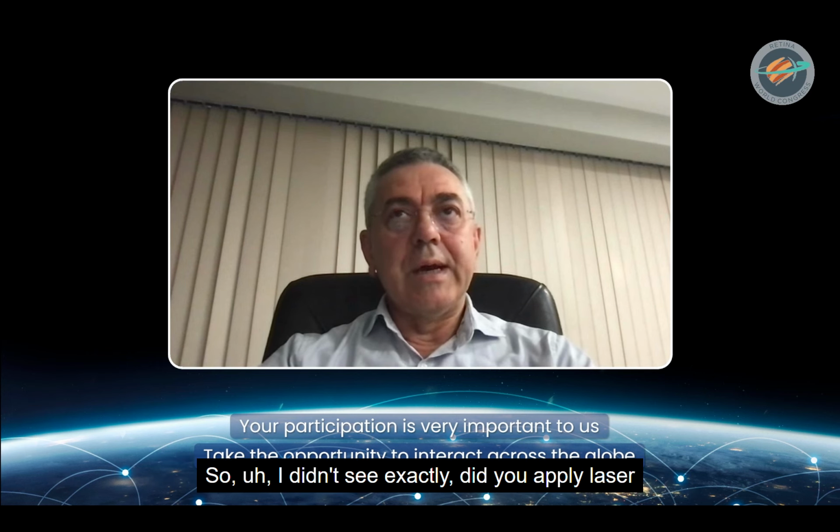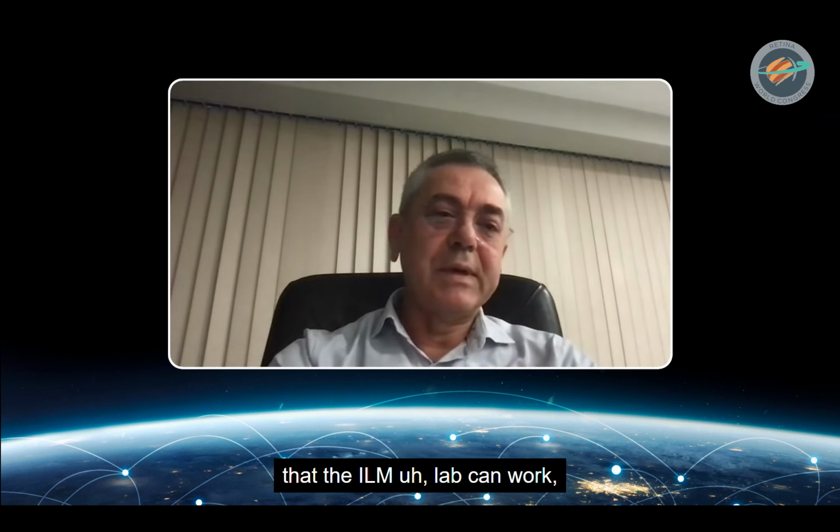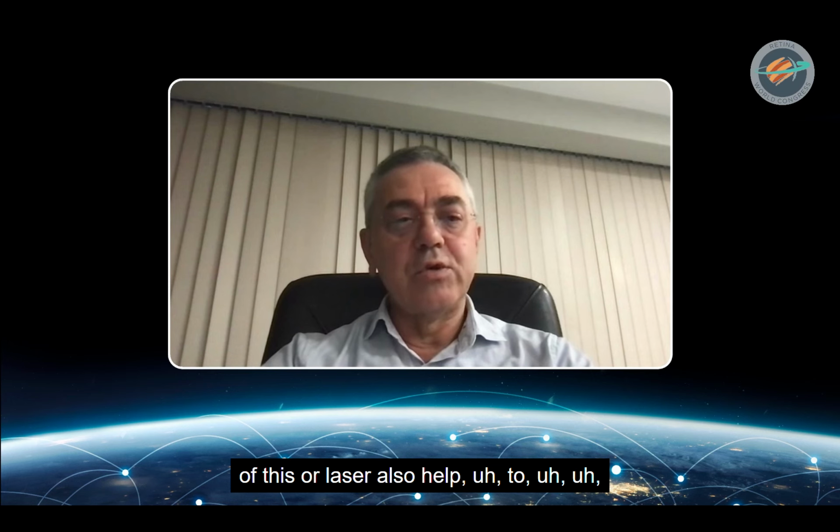So I didn't see exactly. Did you apply laser all around the edge, or only some part of the edge? Why I'm asking this question is because I would like to see whether the ILM flap can work separately without doing any laser, or whether laser also helps to make attachment in this patient.